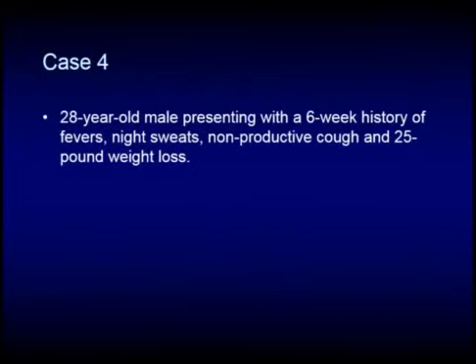28-year-old male presenting with a 6-week history of fevers, night sweats, non-productive cough, and 25-pound weight loss.